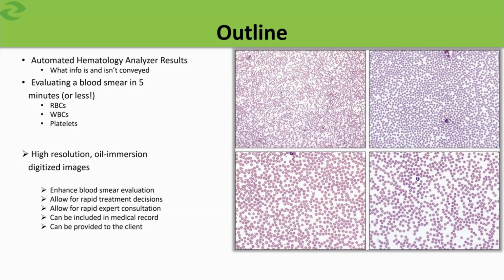And of course, if that's in the afternoon, then an overnight delivery or courier pickup could extend that out to 24 hours. So as we go through today, I'm trying to do this so that you can make a decision quickly and decide whether you need additional consultation on that. One of the other advantages of digitized images is that you can include them in the medical record. You can use them to follow progress, response to therapy, or lack thereof. And you can also provide images to the client, which may help drive the message home as to what the underlying problem is, and how to follow your therapeutic recommendations.